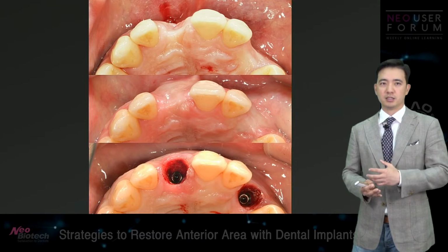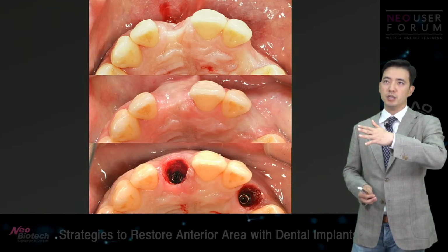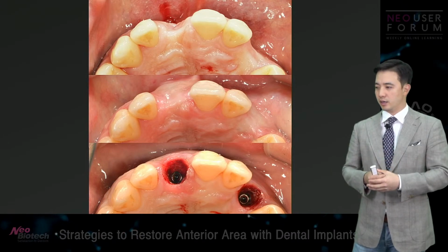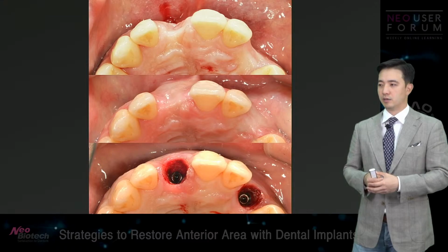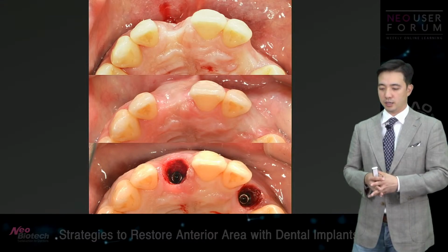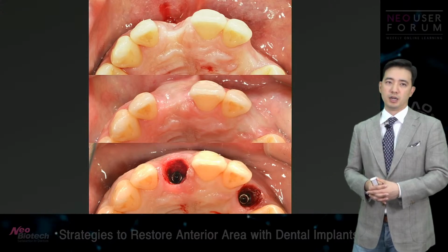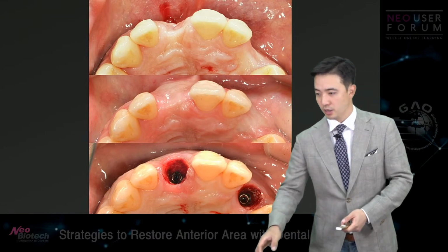It sticks into the bone, and you can't really tell from the CT scan which part is the root and which is the buccal bone. You can't separate them on the CT scan. So I don't really worry about the long-term prognosis after seeing that CT scan. So far, in all the cases that I tried, I really didn't have any complications.